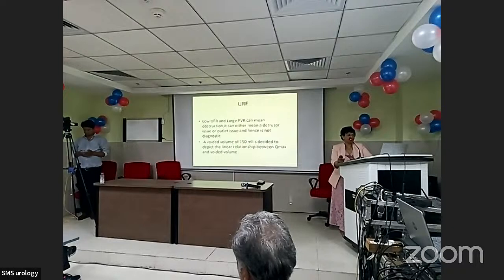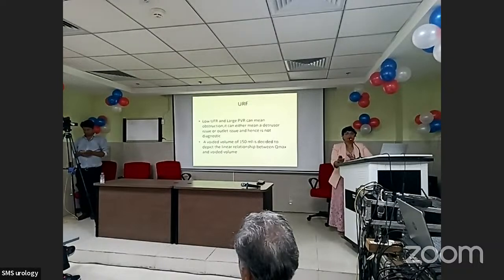Just before that, what is the simplest thing by which we can diagnose obstruction? A low UFR and a large post-void residue, in the presence of a high PDET, is obstruction.